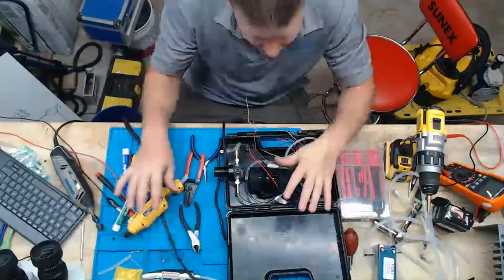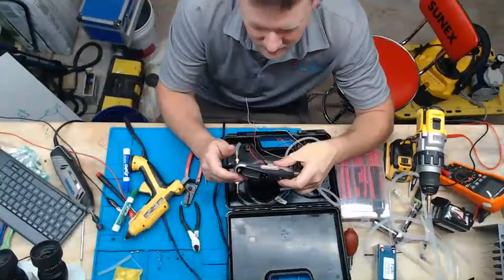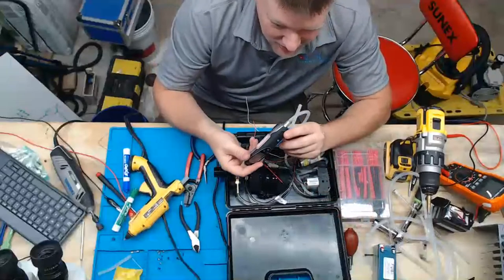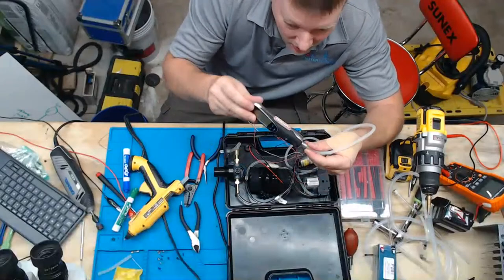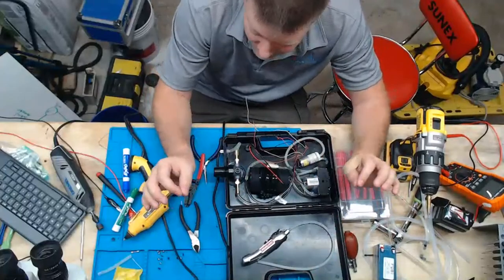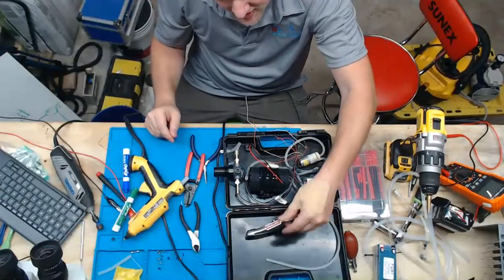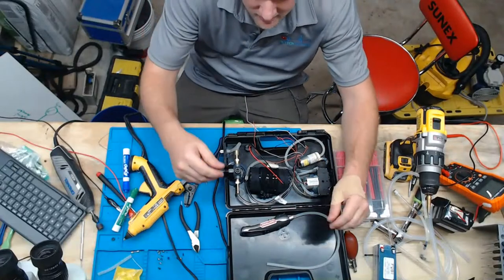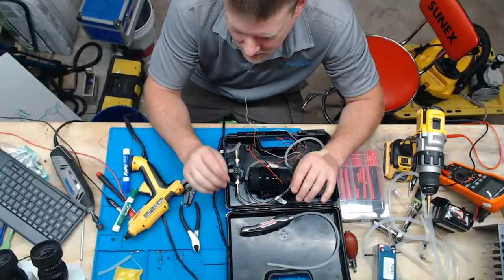I've already tested it out when it scattered across my desk. And I am using very rudimentary stuff. Let me tell you, when it comes to a digital pressure gauge, I have this Craftsman tire pressure gauge for checking car pressure. But once you disassemble it and get down to the pressure transducer, there you go. There is your pressure gauge right there. So it's very crude, but it works. So that's how I can judge whether this design or that design gives me more pressure. And mind you, the highest pressure that I need is 14.5 PSI, which is, I think, 750 millimeters of mercury.